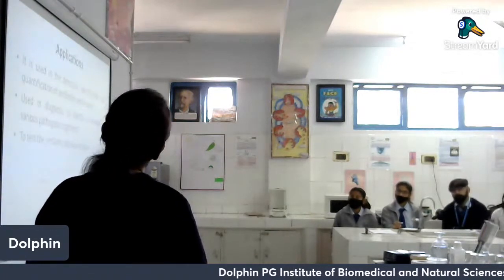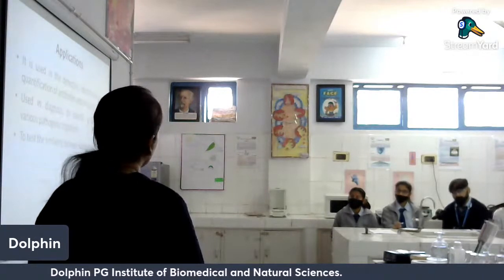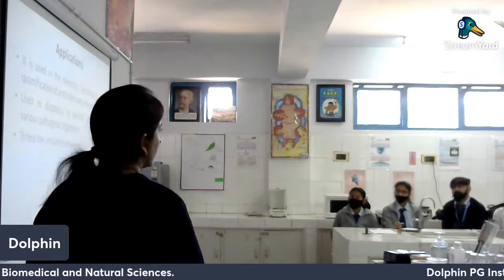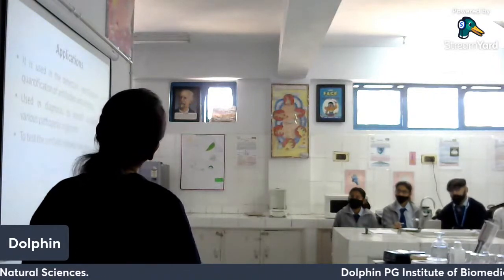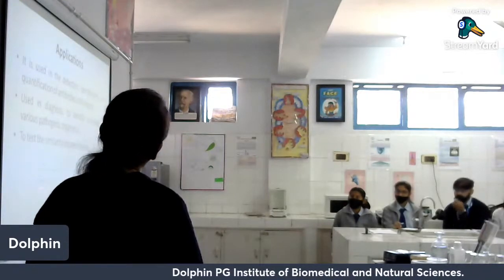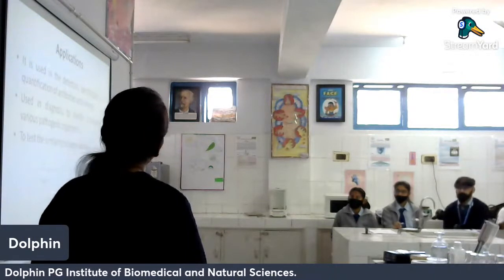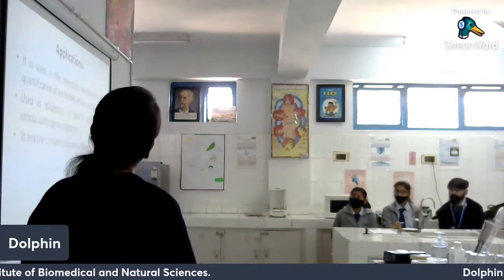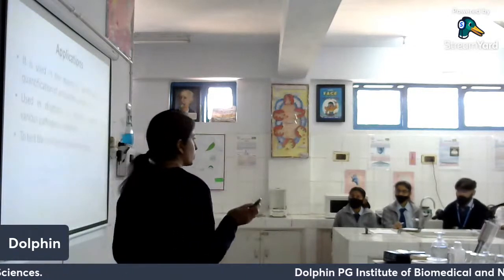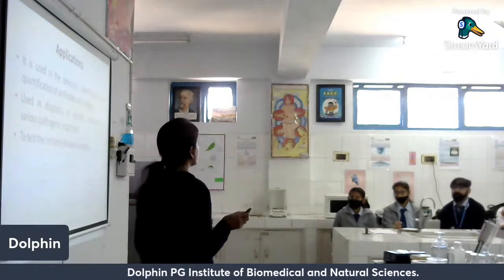Right? If these two antigens are the same, if they are identical, they will interact identically with the antibodies, and you get a V-shaped precipitin pattern. This pattern is also known as the pattern of identity. This pattern tells us that these two antigens are identical. Identical means they have identical epitopes, identical binding sites on their surface.